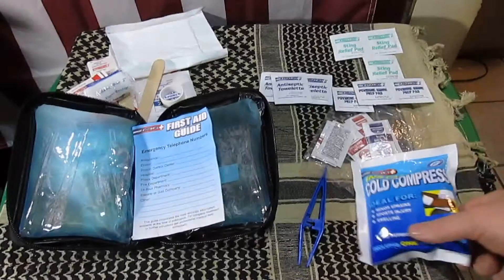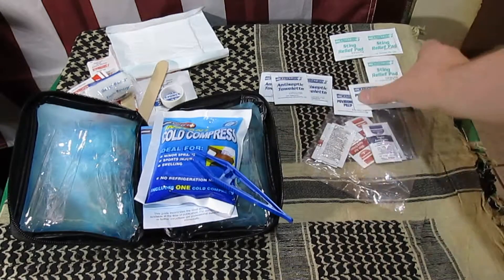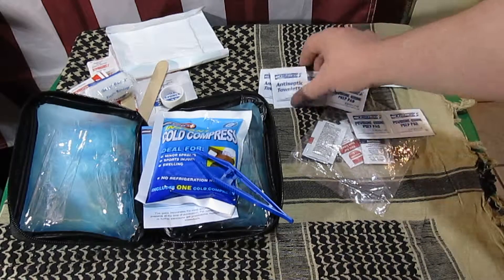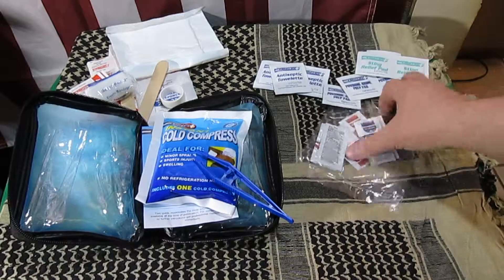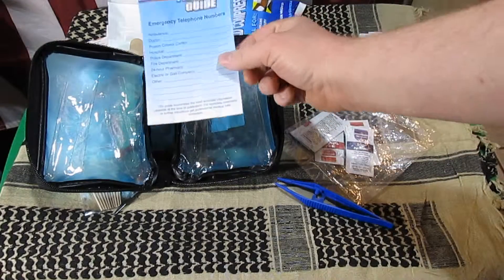On the other side you get an instant cold compress, a pair of plastic tweezers, 3 iodine prep pads, 3 sting relief pads, and 3 antiseptic towelettes. You also get a little packet with 5 packets of burn cream and 1 packet of antibiotic ointment. It also comes with a little mini first aid guide.